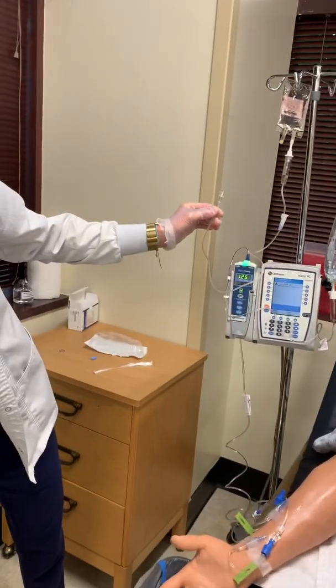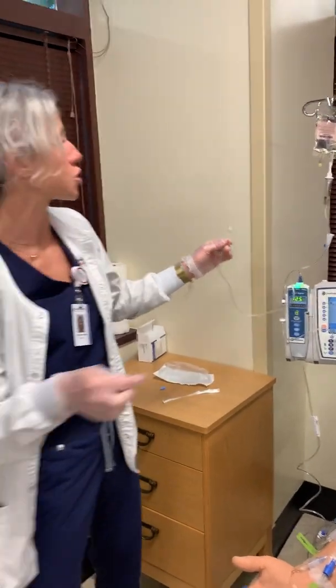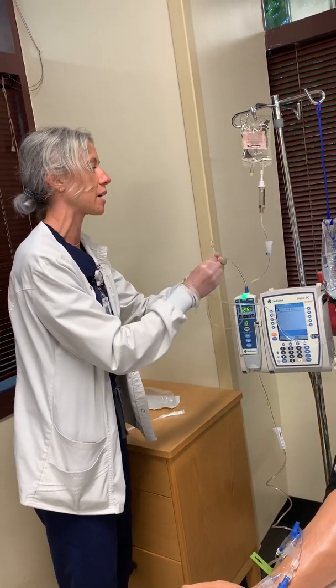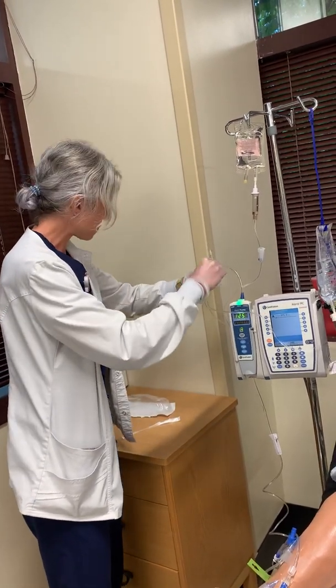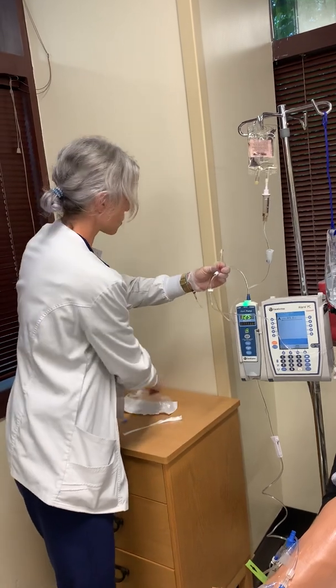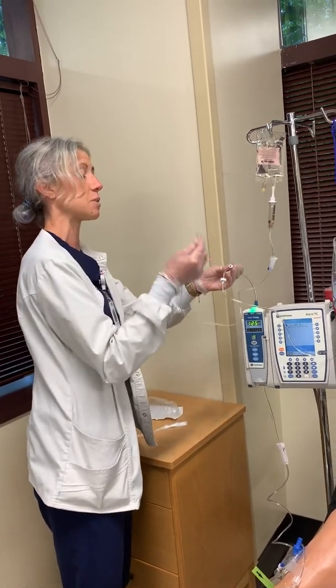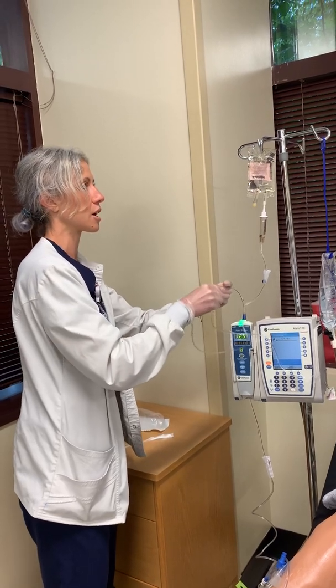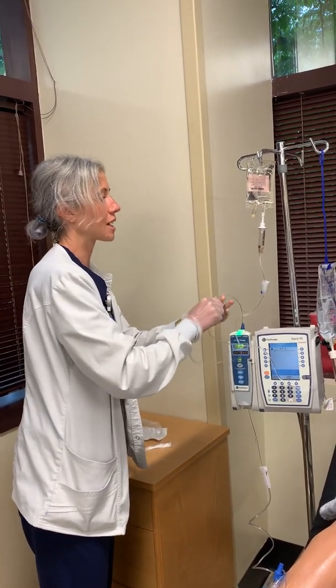So I'm gonna get out my alcohol, okay? As usual, I'm gonna clean that hub. I know you're gonna get tired of us saying this, but you gotta do it, okay? So you're gonna do it like that. And when you're in the hospital, you'll see some caps that people put on the end of this, but this is where this is gonna go, okay? So we're gonna connect our secondary. So I'm all connected.